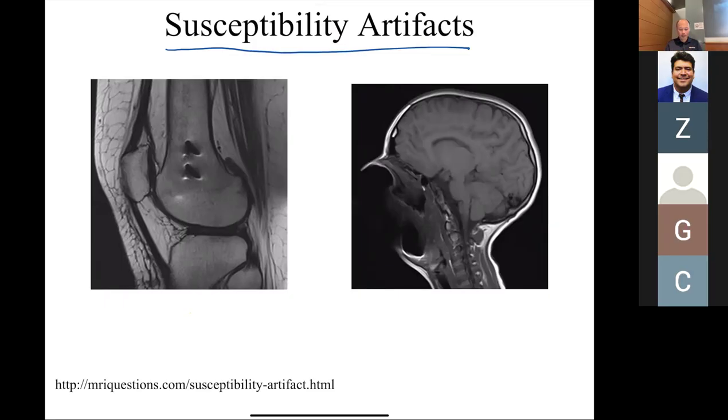What about this poor person on the right here who's missing a mouth? Okay. So what should we do about this person? First of all, do we think that person is actually missing their mouth? No. Okay. So what could cause this artifact? Yeah. The air in the mouth.